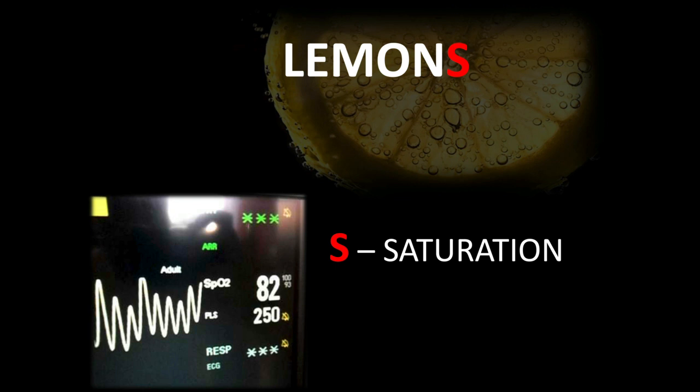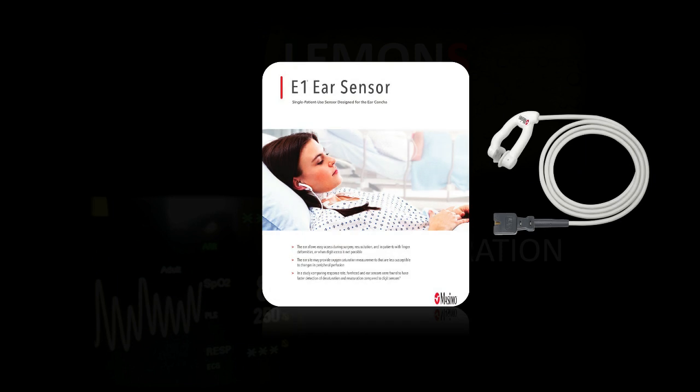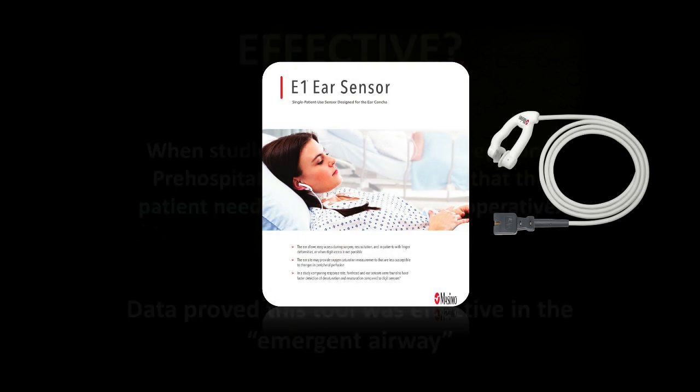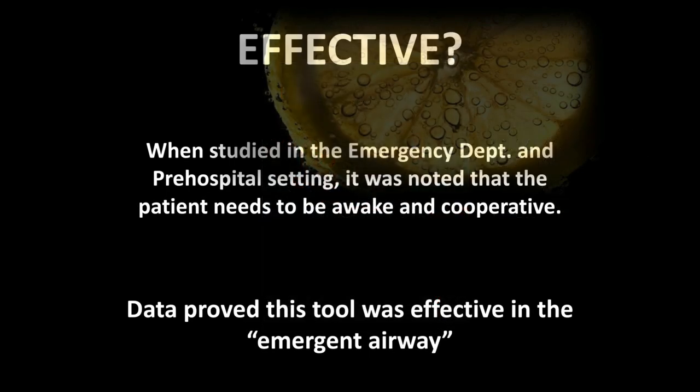When we're in shock, all that core blood goes into that core area to our brain, our heart, our liver, etc. And so that is a very hyper-perfused location that's going to be pretty instantaneous and give you a true reflection. So understand SpO2 latency. Understand if your patient is cold, if they're older, if they're on medications that might blunt their compensation, you're definitely going to have an alteration in that SpO2. So make sure you have good pleth and change positions or locations if you don't feel like you can trust that number.